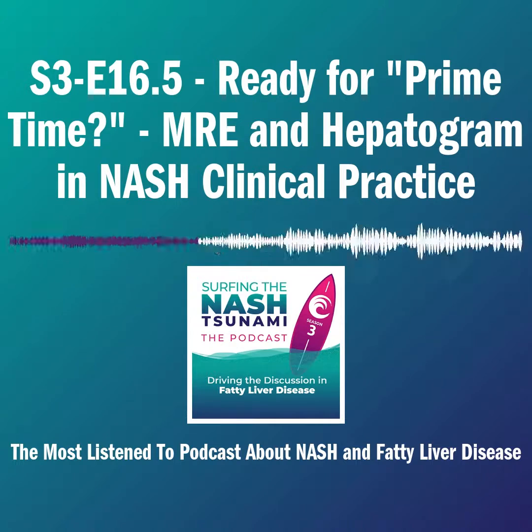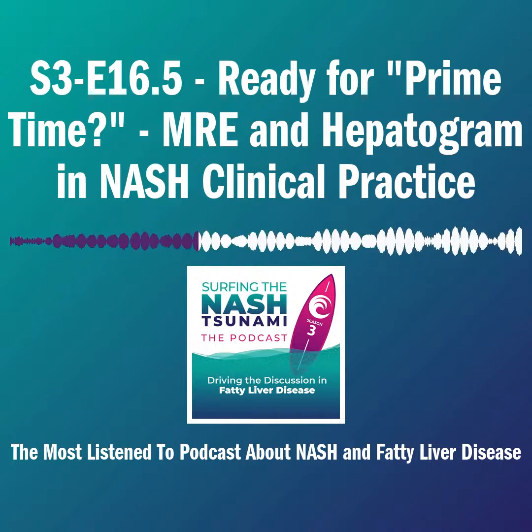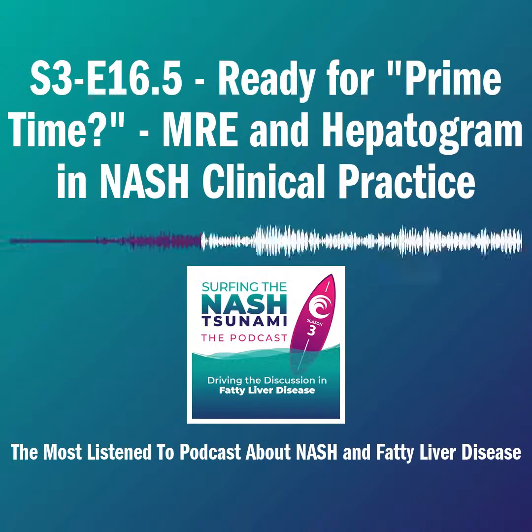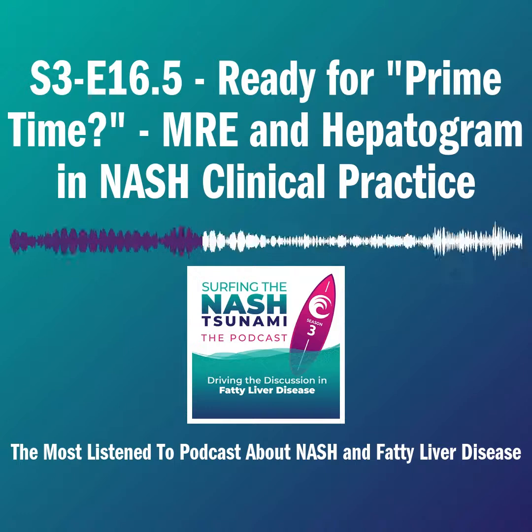We have a few different protocols. One, we have what we call a rapid fat iron protocol, which we use the methods that we use for PDFF. Also, we can quantify liver iron too, and we can talk about that later. So in one breath hold, we can get liver fat and liver iron concentration, LIC. What we've been charging for that is an MRI abdomen without contrast with a limited 52 modifier, which is basically about half the price of a regular non-contrast MRI. And it turns out the cost for that is about the same as an ultrasound. So PDFF and LIC are about the same cost as an ultrasound.